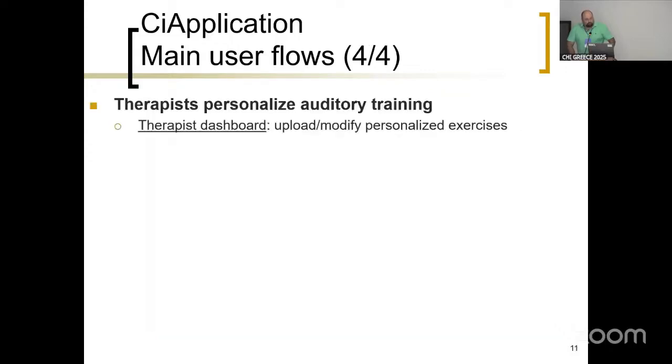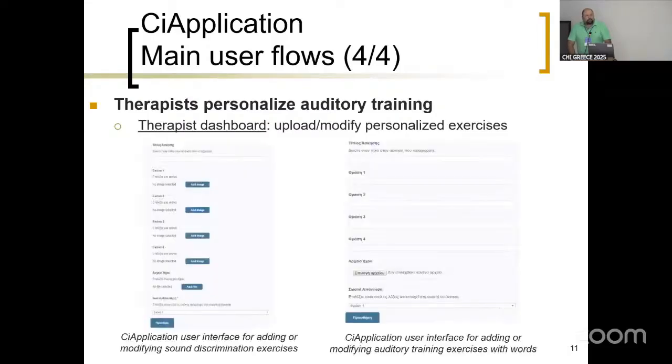Now, moving on to the other main typical user, which is a therapist that personalizes auditory training. He has a dashboard to upload and modify exercises for the people he actually treats. You can see here some screenshots. I won't go too much into detail, but the main idea is for him to be able to easily upload his material, select what type of exercise it is, and add images or sound stimuli he has recorded, he has downloaded, and so on.